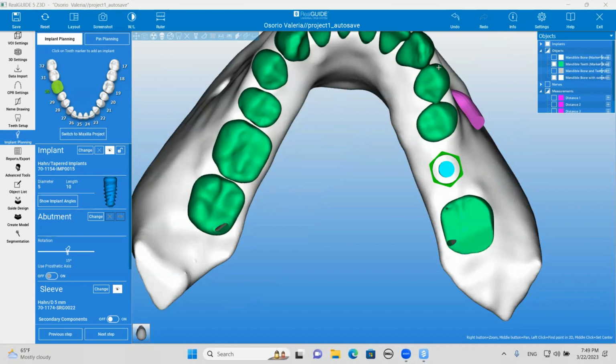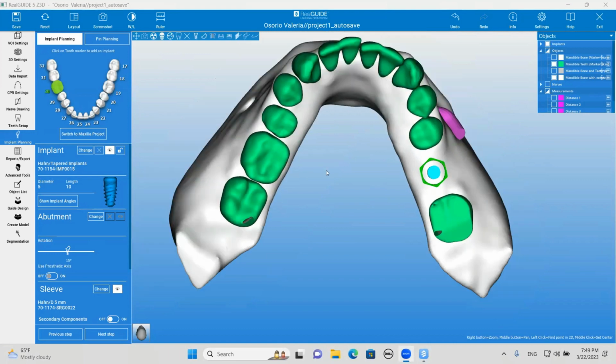Okay, good. And in that case, would you still release the flap so it covers the whole thing? Yes. I mean, ideally, anytime we graft, we always want to release. Now, where we have problems, as you know, is when we do immediate placement, because then it's very difficult to get primary closure. But on this one or the case prior, both of those cases, I would definitely get primary closure, and you could do that very easily.